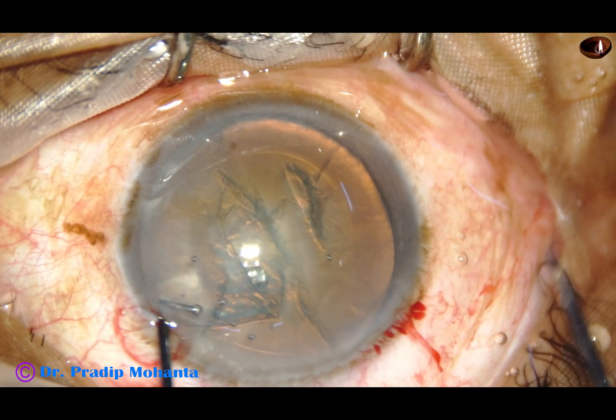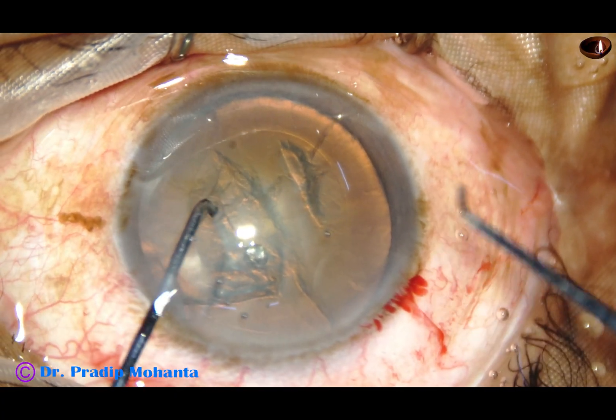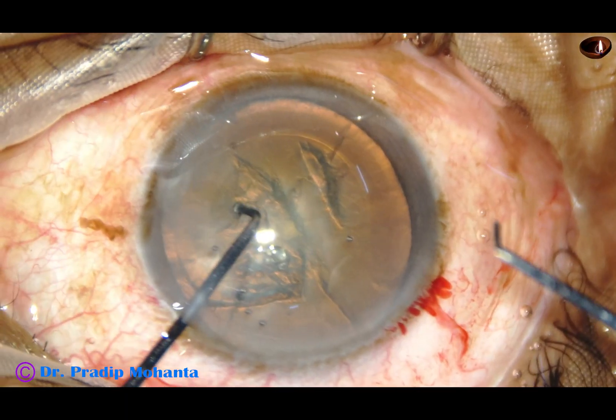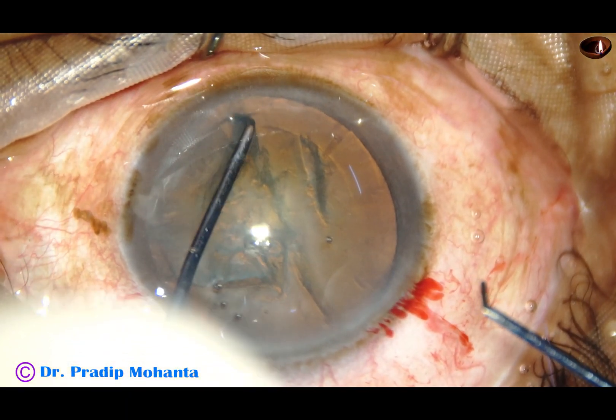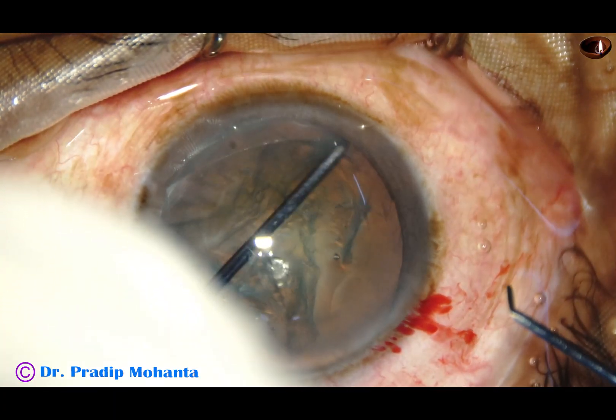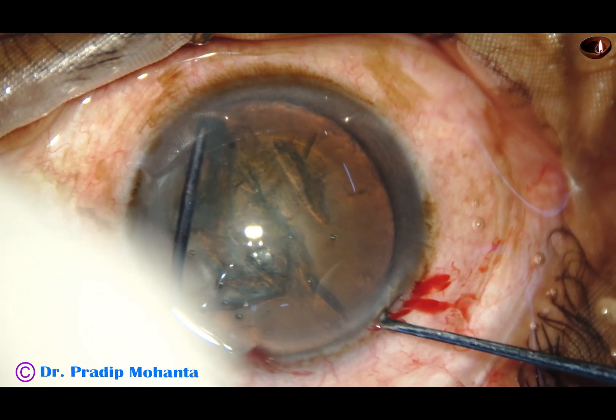Here goes the nuclear sustainer through the side port. Go in this way, stand vertically. Now pronate your hand a little more and see — the ball tip faces the equator. Go, scratch the surface of the lens and cataract, go under the rhexis margin, and hook the equator.